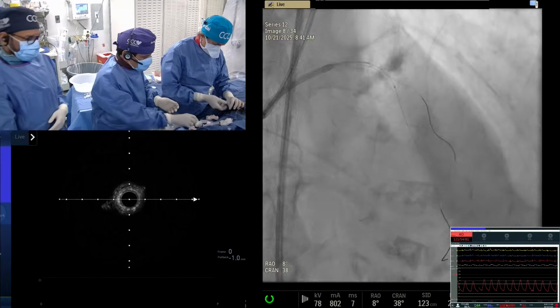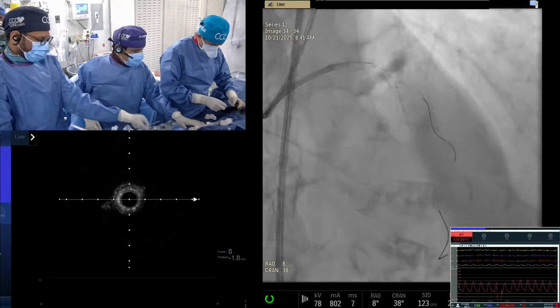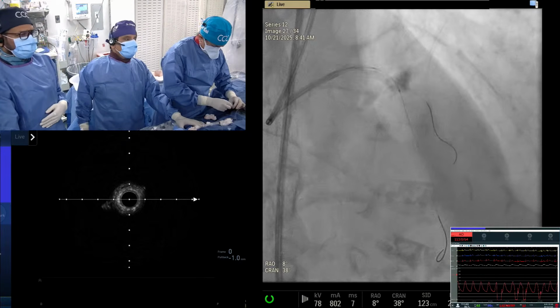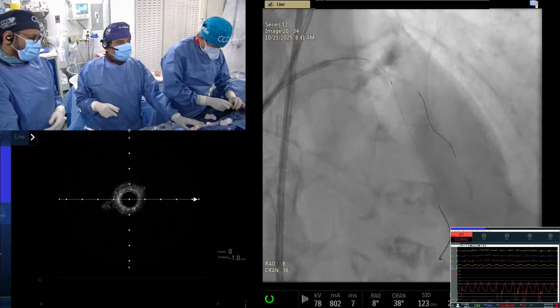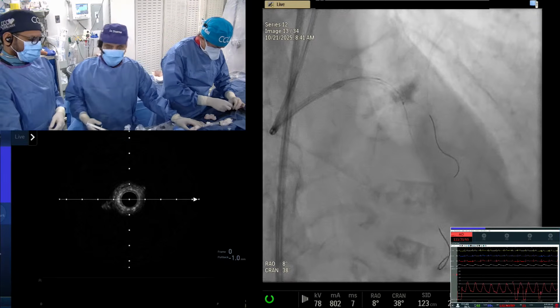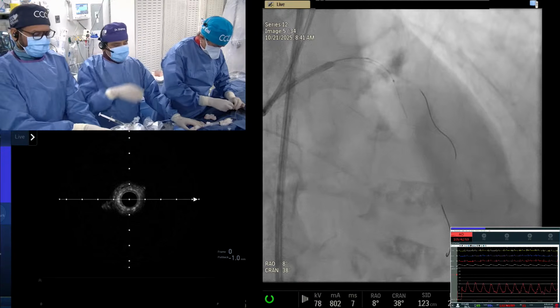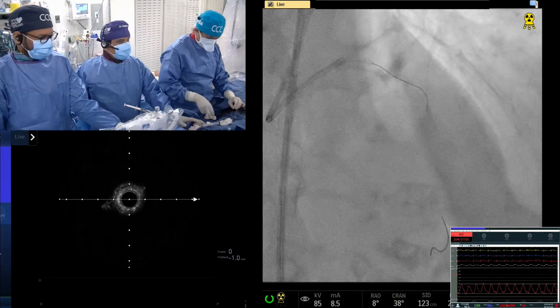And if it's just short, just at the ostium, then you can do either IVL or just the cutting balloon. Okay. Actually, you know what, that's very interesting, Samir, you just said. In the original angiogram, it looked like a lot of calcium in the diagonal, but here it looks to me angiographically none. I mean, mild. Just a little sheet of calcium, which you can only see when the cardiac silhouette is moving.